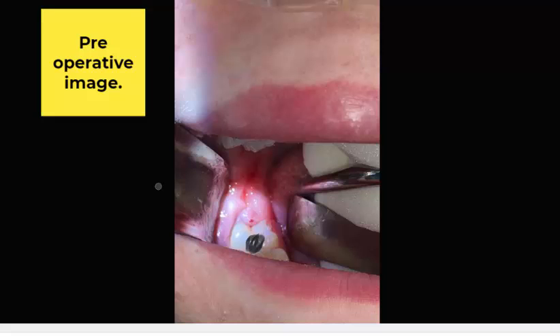We had the basic envelope flap that I'm going to show you here. Then there's the three-corner flap, when you take an envelope flap and do one vertical releasing incision. And then there's the four-corner flap when you do two vertical releasing incisions. Those are the three basic flap and incision designs I've used to do 99% of my oral surgery in my two decades of practice.